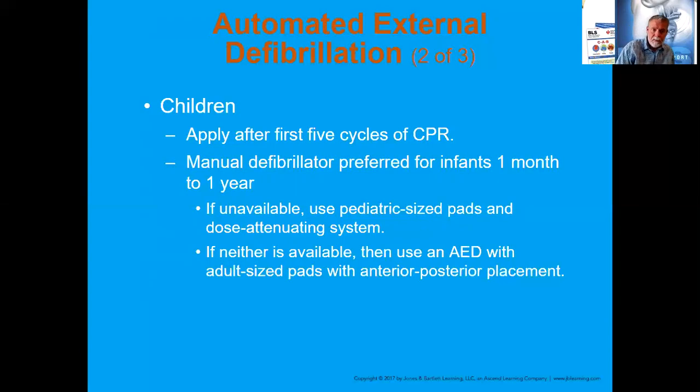But if you don't have it, you can use the pediatric pads, even the adult pads, in what's called an anterior posterior position. So we put one on the front and one on the back. The other great thing about an AED is that it only shocks if the patient needs it. So again, fantastic. It's safe for you to use.